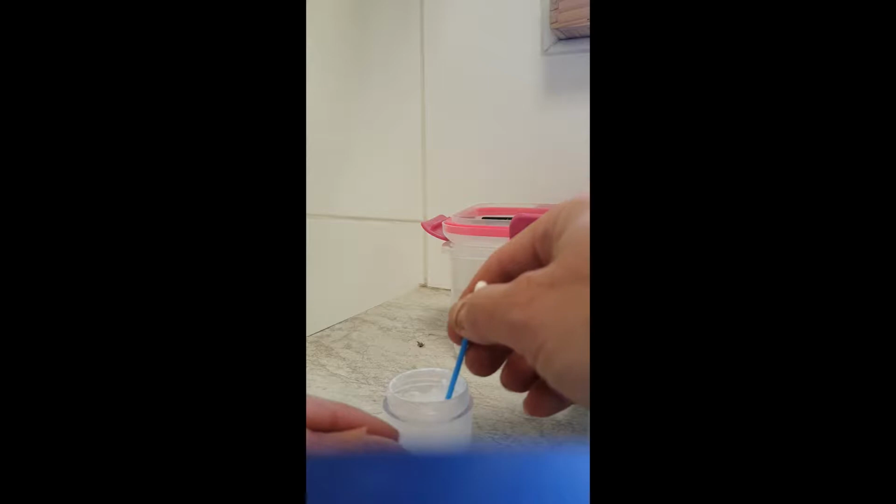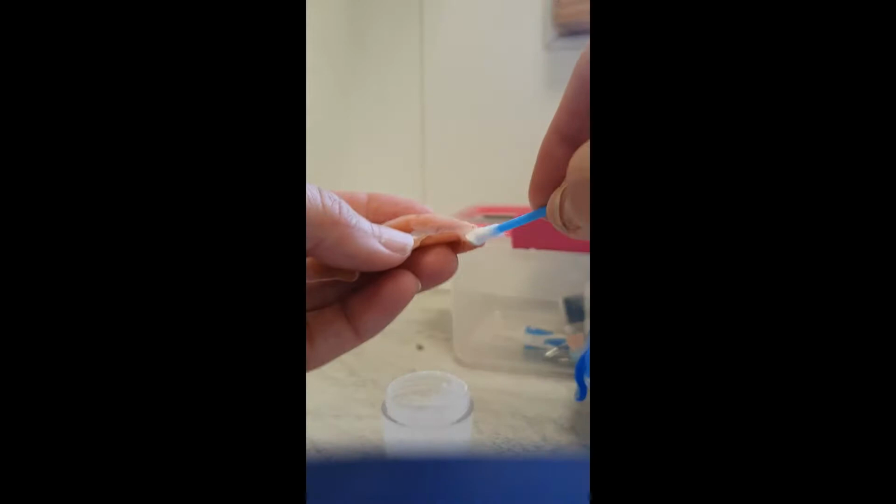Okay, so now we're going to. Okay, this is tightened quite tight because of the glue. Let's put it there. So use this, dip it in my glue, and now in my ear. You can see the glue is white. Okay, now I need to carefully do the ear. You can see what I'm doing.